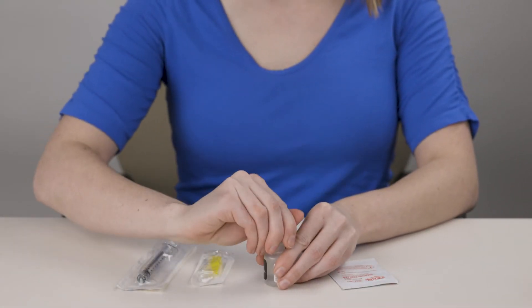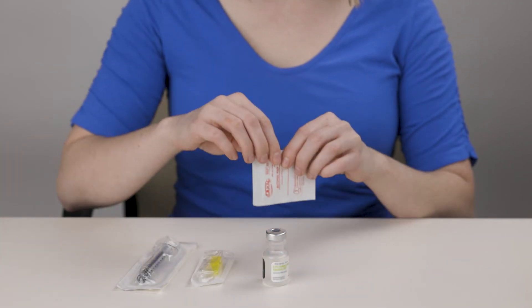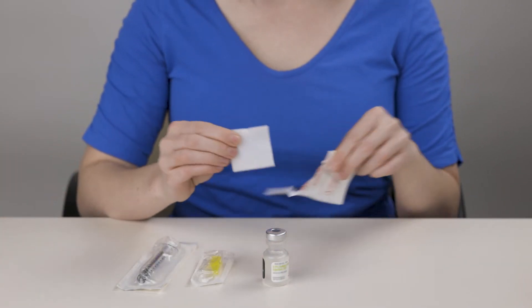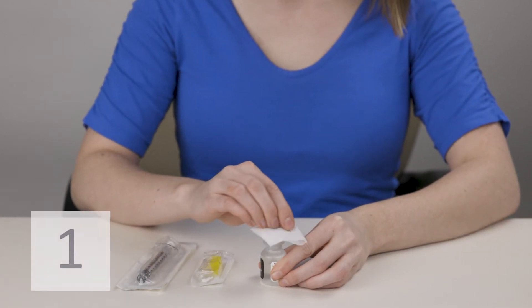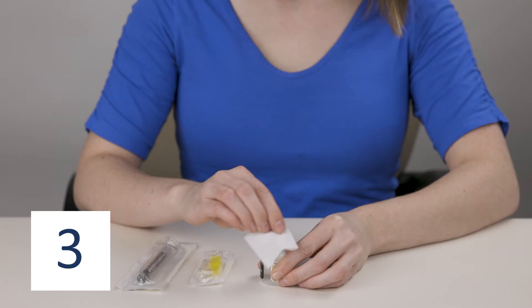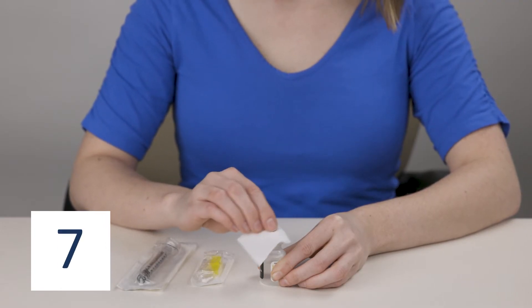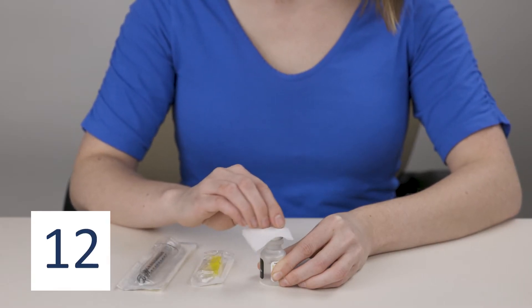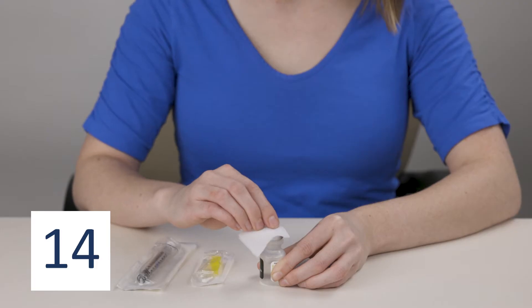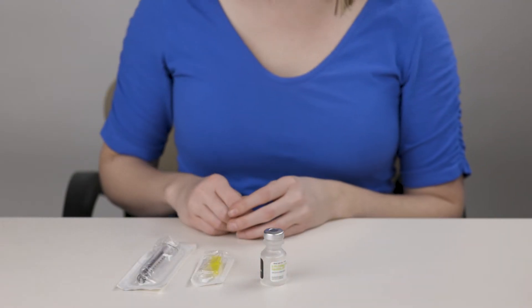Remove the cap from the medication vial. Open an alcohol wipe. Clean the top of the medication vial with the alcohol wipe for 15 seconds. Let the vial air dry for 5 seconds.